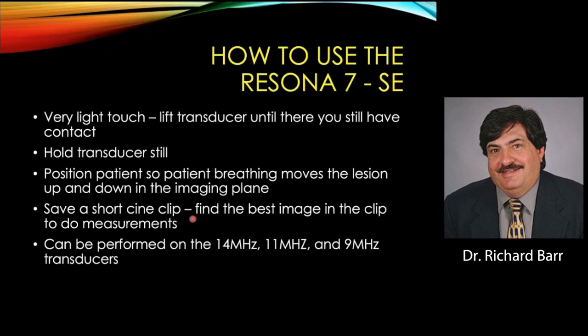Again, we're going to use the very light touch. Lift the transducer until you just have a little contact. You're going to hold that transducer still. Position the patient so as they're breathing, the lesion moves up and down in the imaging plane. And I'll try to do that in front of you here.